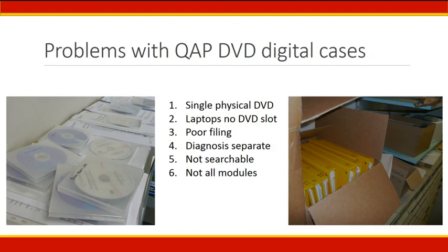And last year I was at the Children's Hospital at Westmead, which does paediatric pathology, where there was no subscription to the breast, gynae, uropath, neuropath, oral or forensic modules because they were not relevant to the work type. But for me as a registrar, I need exposure to this common adult pathology. So how do I feel using the QAP DVDs? Typically frustrated and disappointed at the gap between this great digital material and the problems with actually accessing it.